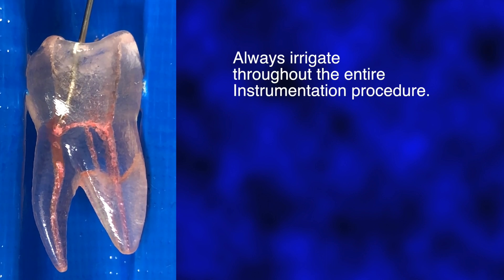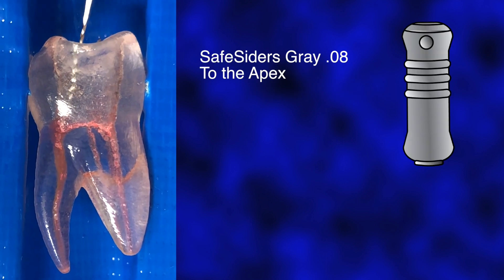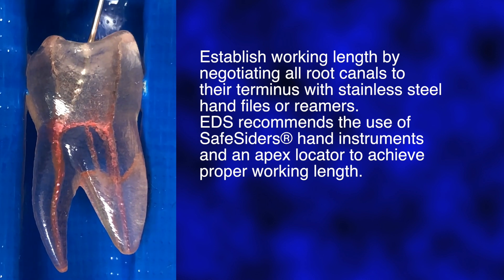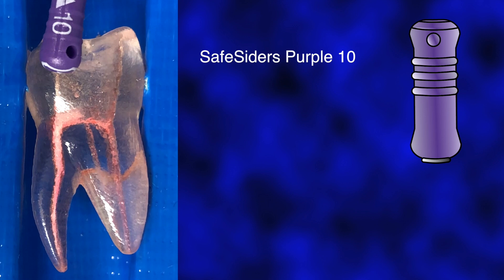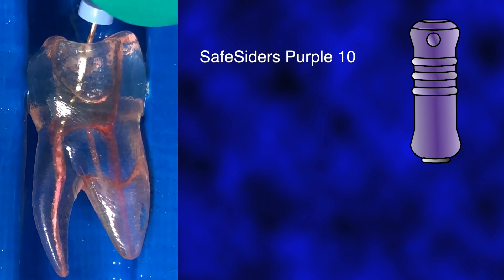As with any endodontic instrumentation procedure, create straight line access to the canal orifice and always irrigate during the instrumentation process. Establish working length by negotiating all root canals to their terminus with stainless steel hand files or reamers. EDS recommends the use of SafeSiders hand instruments and an Apex locator to achieve proper working length. Obtain the working length with a hand file, ISO 10 or higher, preferably using an Apex locator.